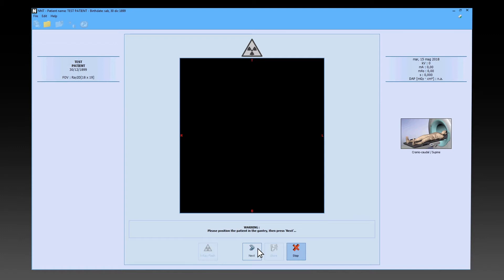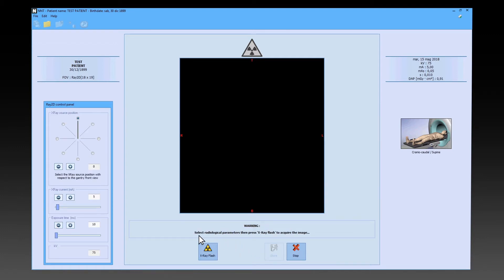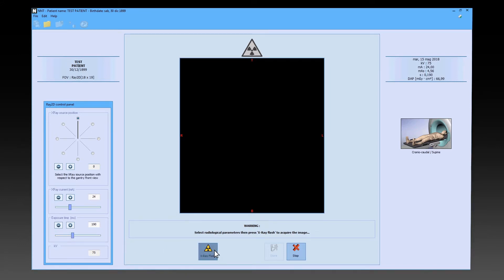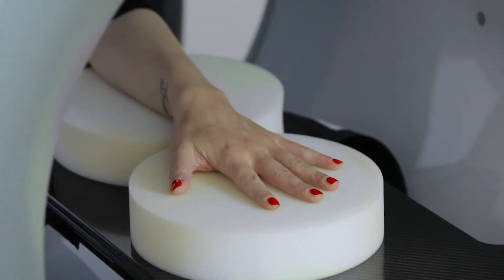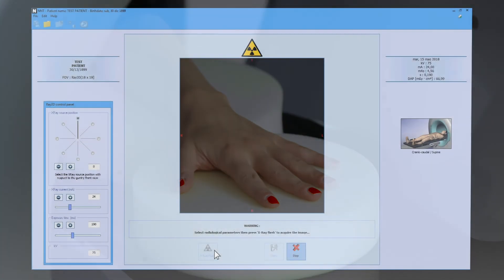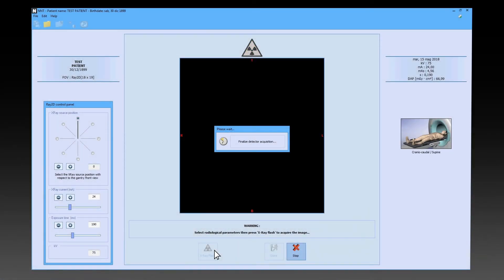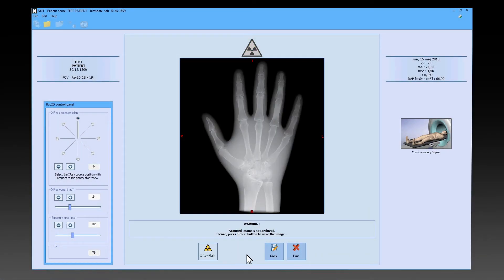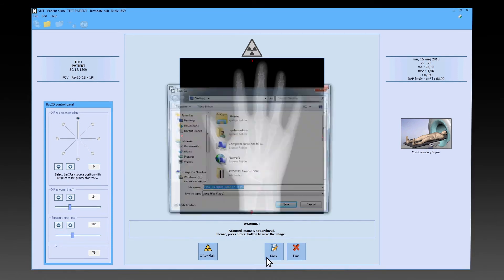Now the physician can press next and return to the console to select the capture parameters, especially the angle at which data acquisition is to be performed. Pressing the X-ray Flash button launches image acquisition. Each image must be saved manually to the patient folder.